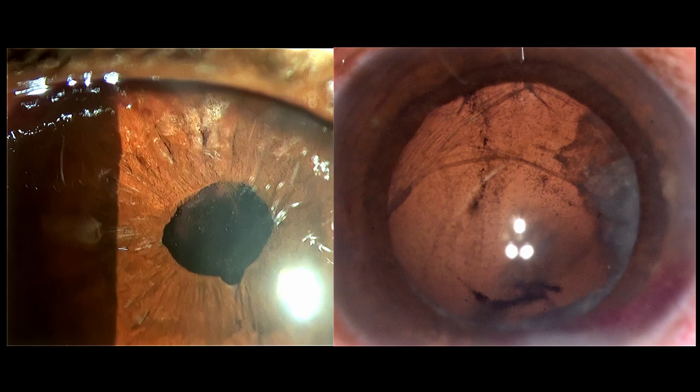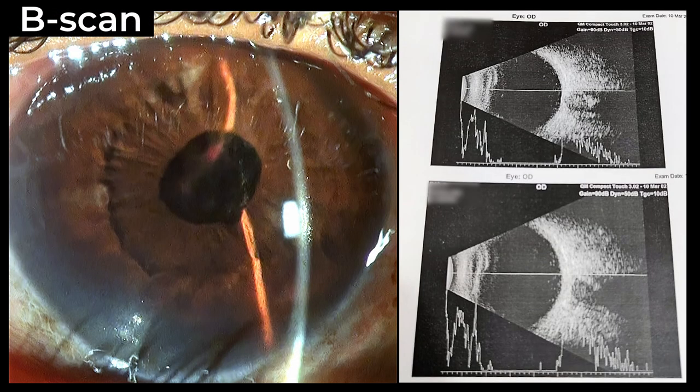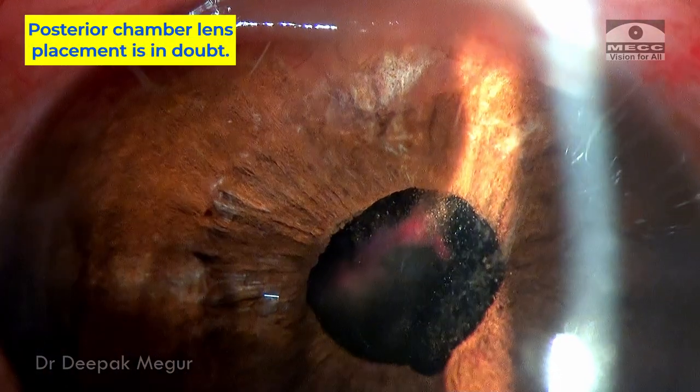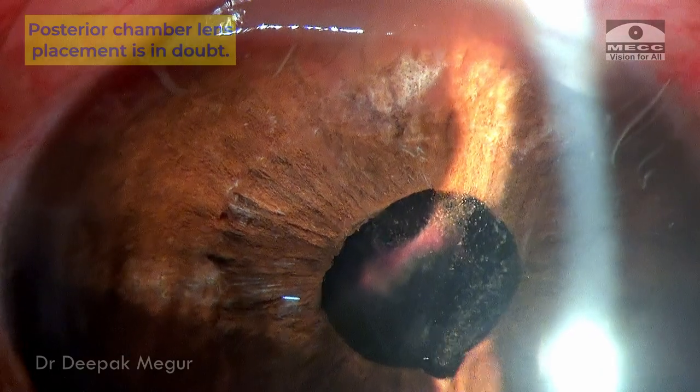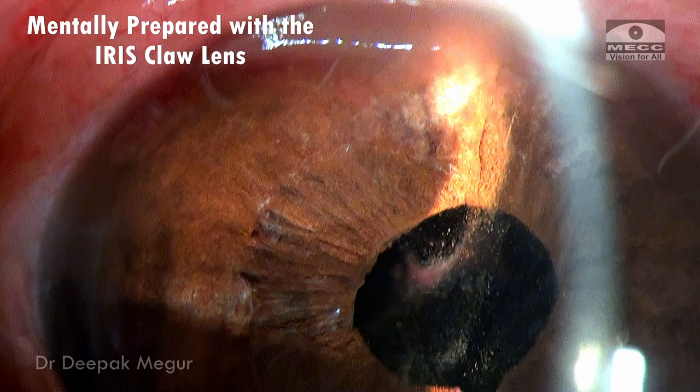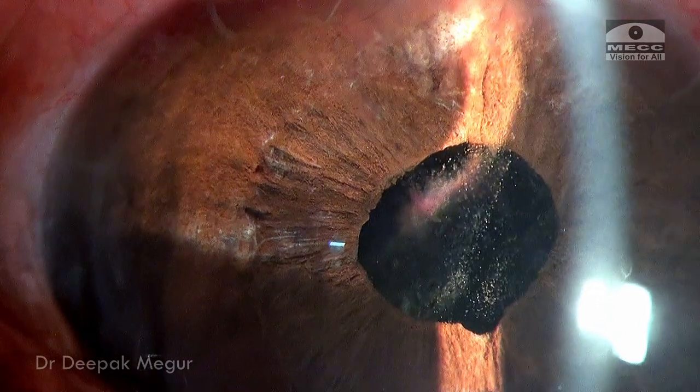On dilated examination, there was some evidence of posterior capsule, but it was not clear enough whether it would be sufficient to place a posterior chamber lens. Because the visibility is quite muddled, a B-scan was done and shows that the retina is attached and vitreous is clear. I have mentally prepared myself to implant an iris claw lens and if possible a posterior chamber lens if the support is adequate.